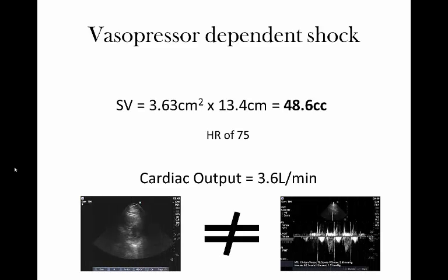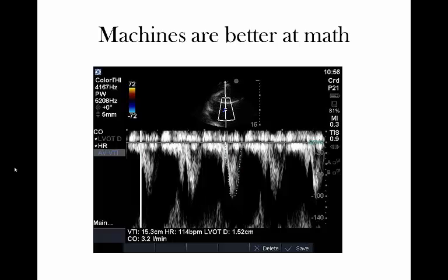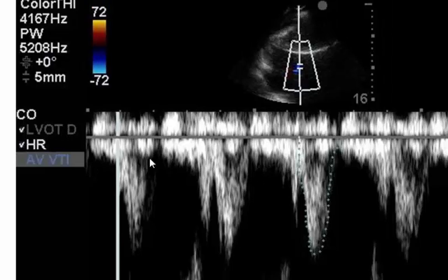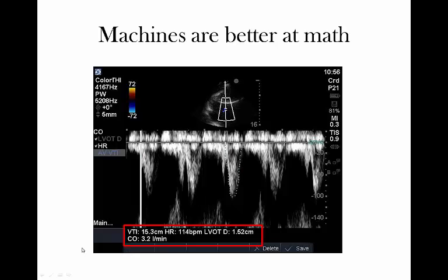Once again, we can agree that ejection fraction or left ventricular function, as shown in this case, doesn't really equate with actual stroke volume. And before you say this is all nice and good but you're never going to do the math — most machines, including the Sonocyte machine depicted in this tutorial, will do the math for you using a cardiac output setting. If you punch in the diameter and the heart rate and measure the VTI, it'll spit out all the numbers for you, which is quite handy.